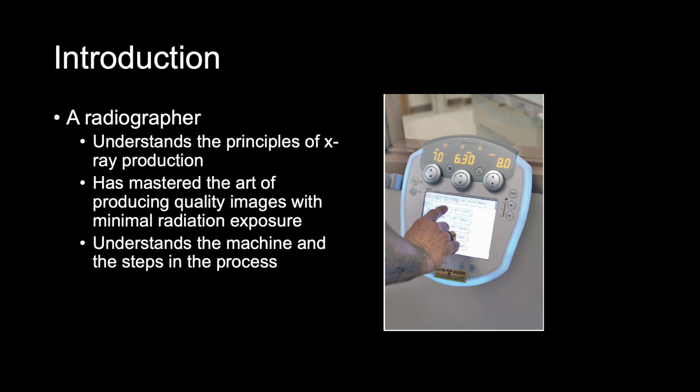You can see here in this picture, this is a machine control panel. This is just one of the several different varieties of control panels that you will see at clinicals or when you're working out in the field. They are all different.